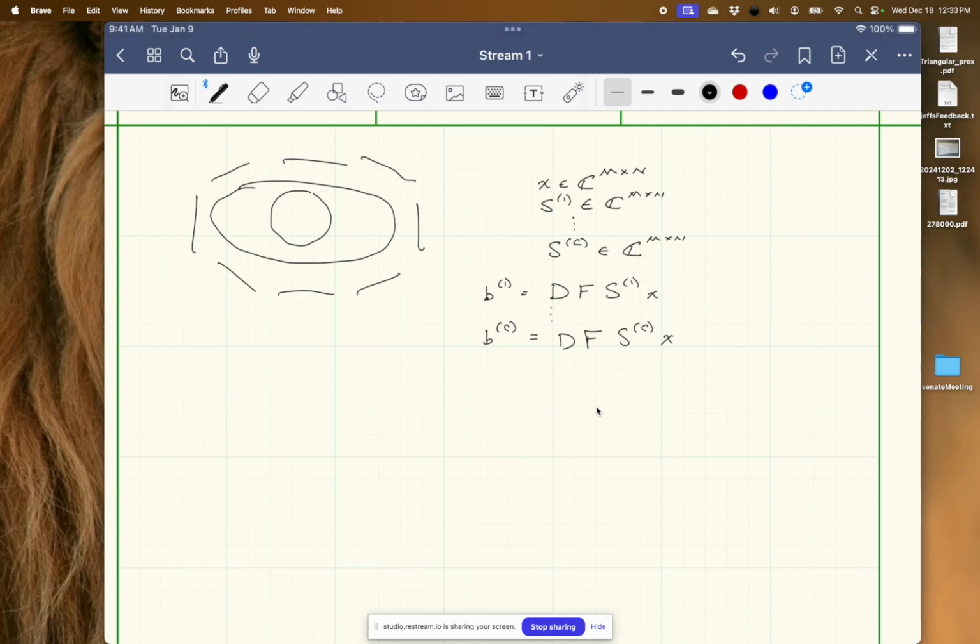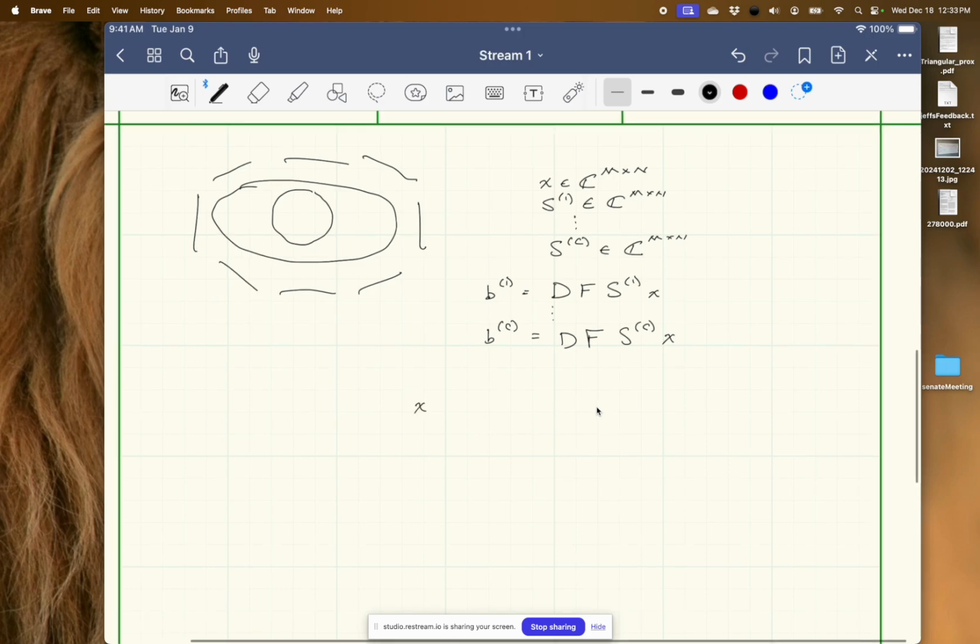So we could rearrange this into a giant matrix system. We have our vector x. Then we can make a block column matrix of the sensitivity maps here. Each of those sensitivity maps, each coil's image, S1 x, gets Fourier transformed like so.